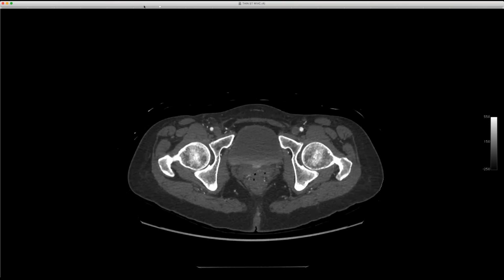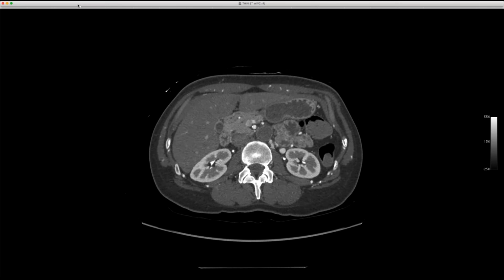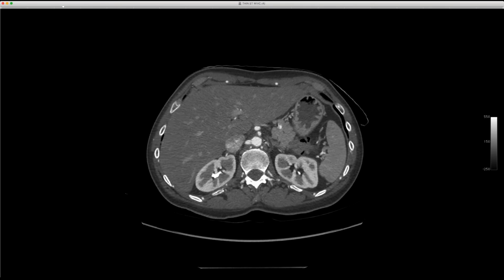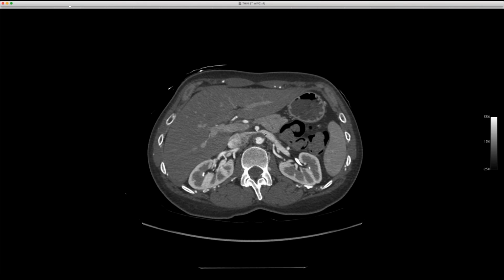She also may have what's called nutcracker syndrome, something I had remembered vaguely but couldn't remember all the details about. Her superior mesenteric artery comes off at a pretty steep angle right off the aorta, and the left renal vein crosses right here, and you can see it's compressed. This can cause intermittent hematuria, pain, ischemia to the kidney. It often has to do with exercise and positioning. But we don't have any dynamic images on this, but this is a presumed, or at least a possible, nutcracker syndrome, where the SMA and the aorta compress the left renal vein.